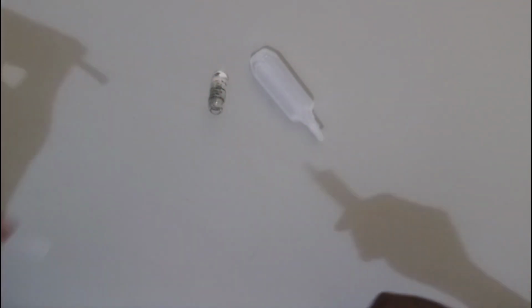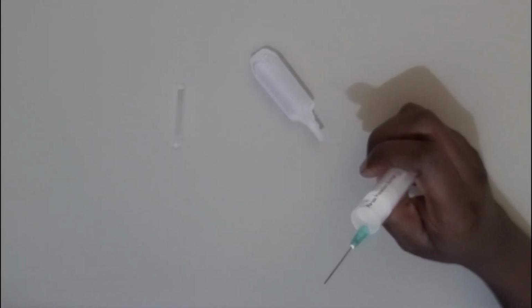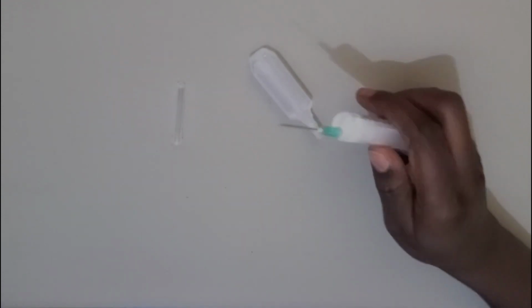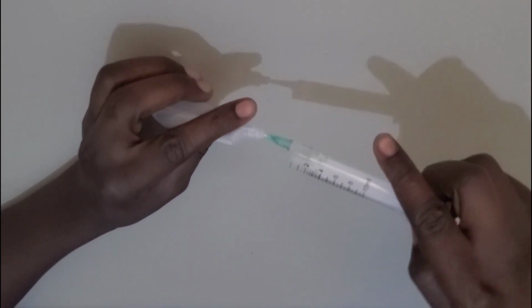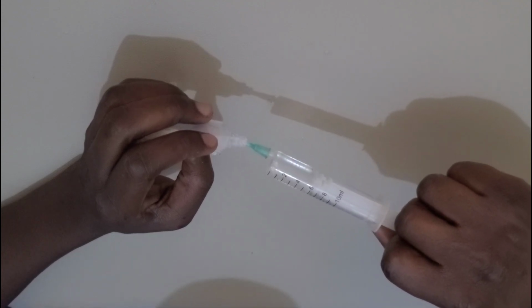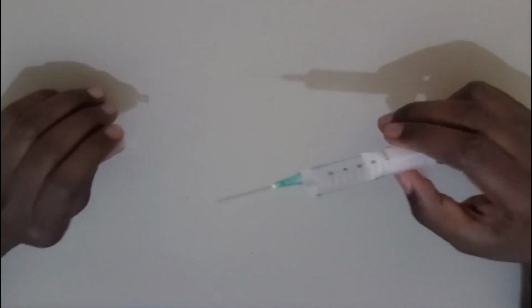We aspirate the medication. We expel the air. After that, we are going to get the 6 mL.